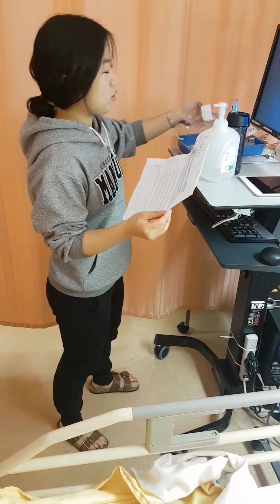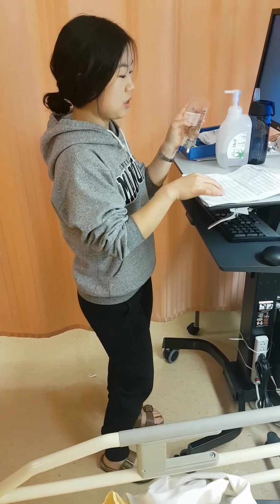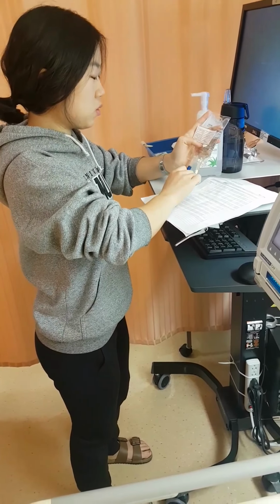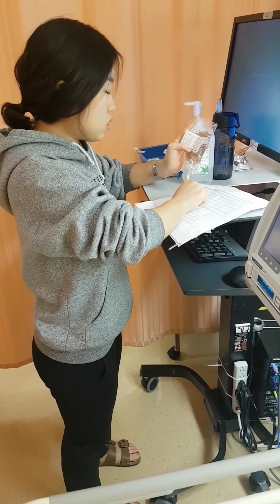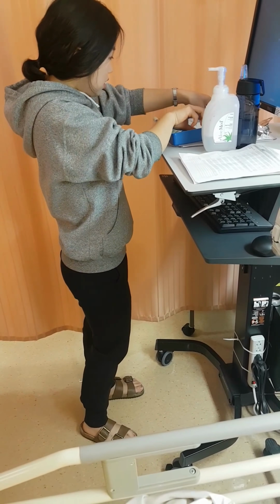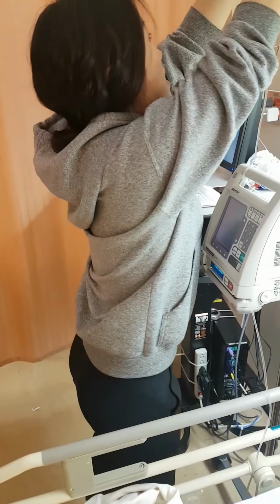And I'll complete my third MAR, or med check, by comparing it with the mini bag and the MAR. So the patient's name is John Smith with no known allergies. The drug's name is Ceftriaxone. The dose is 1.5 grams. The route is through IV, and it's ordered. And the time is every 24 hours, and it's due now.